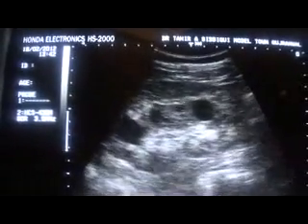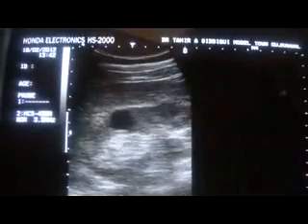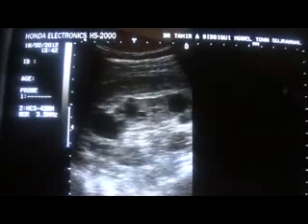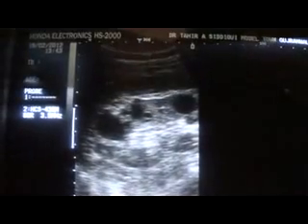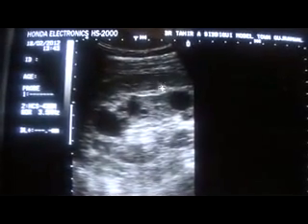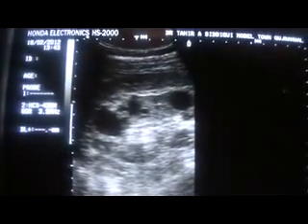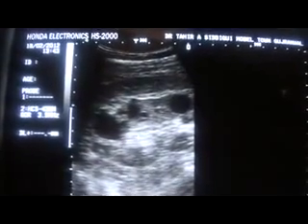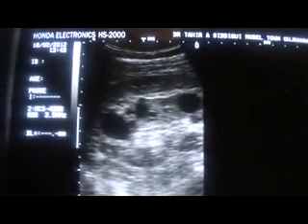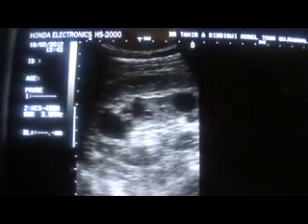Now, all that I have said, the opposite of this you will see in polycystic kidney, in which the cysts will vary in size, but they will bulge around the capsule. The capsule will also bulge with the cyst. The central sinus echo complex will also be involved in polycystic kidney. Polycystic kidneys are more common in childhood, but adult polycystic kidney is a documented entity.